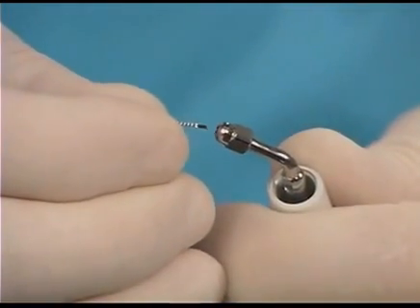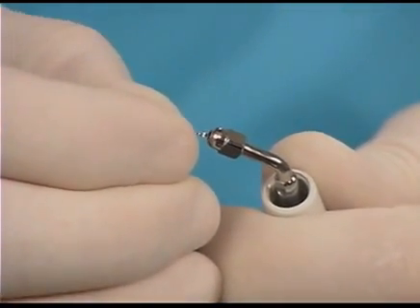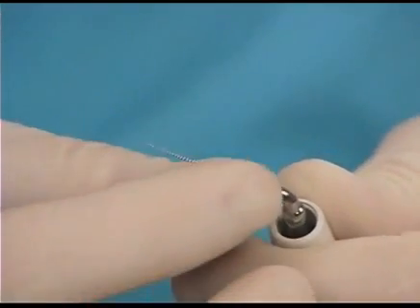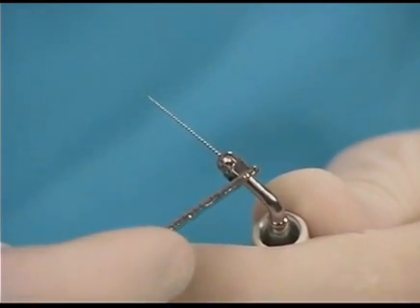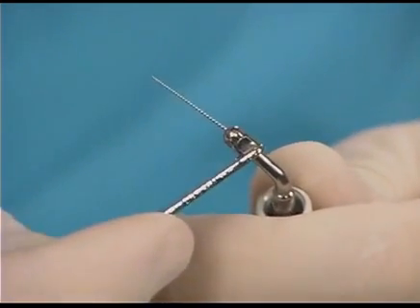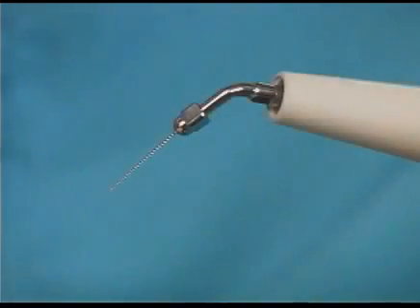The file adapter threads onto the ultrasonic handpiece and its chuck will retain an O2 tapered hand file. Although tedious, small stainless steel hand files can be pre-curved, inserted into available space, and used at low power in an ultrasonic effort to remove a broken instrument. This technique is at times useful when the root is thin and/or the canal is curved.